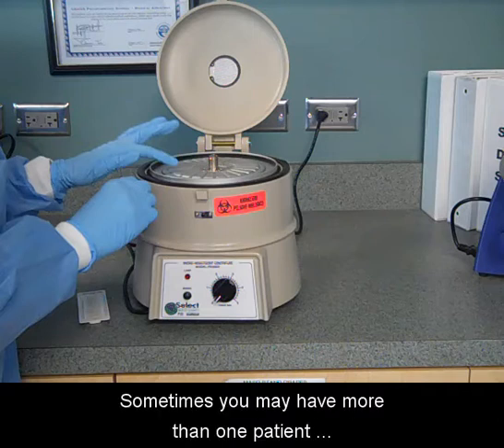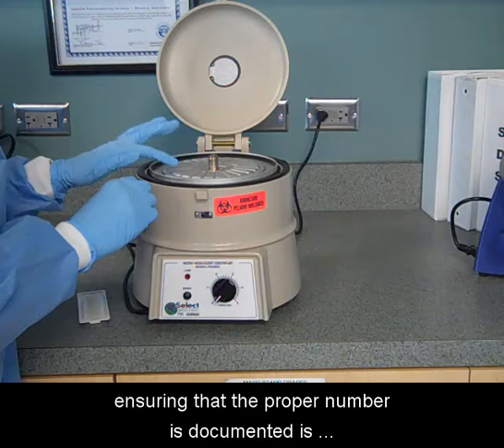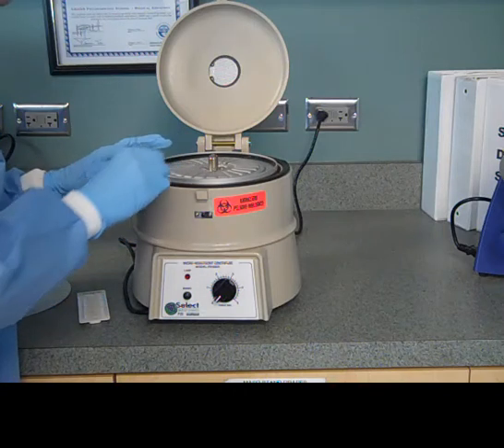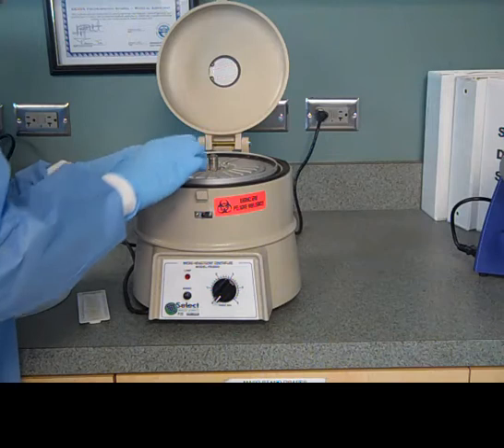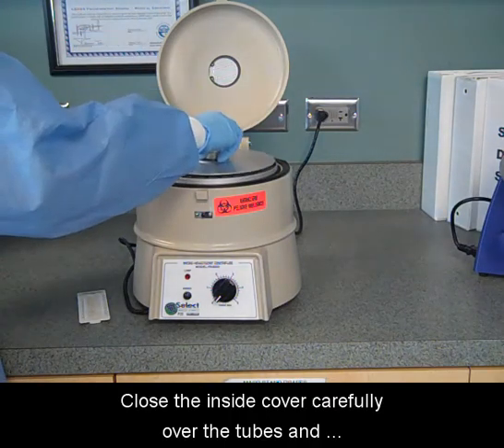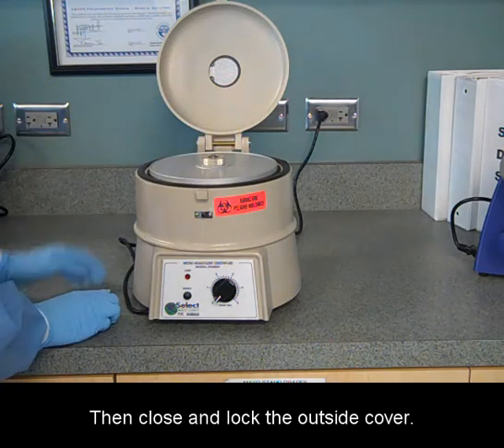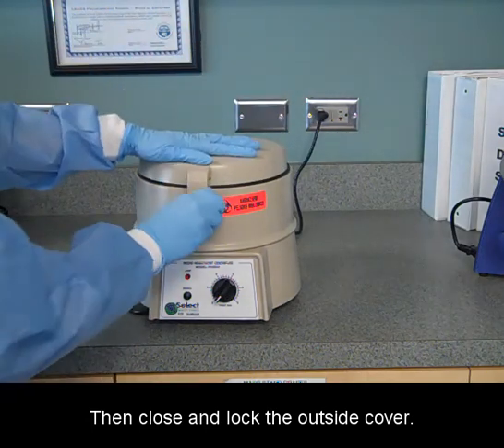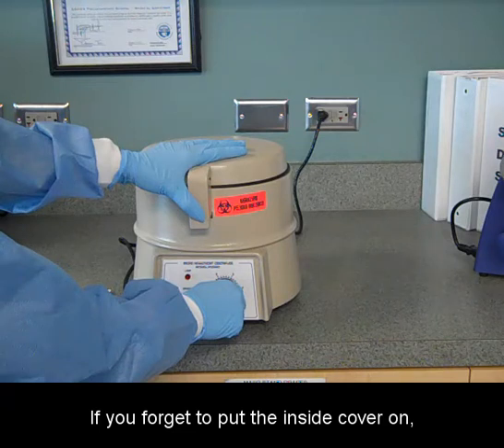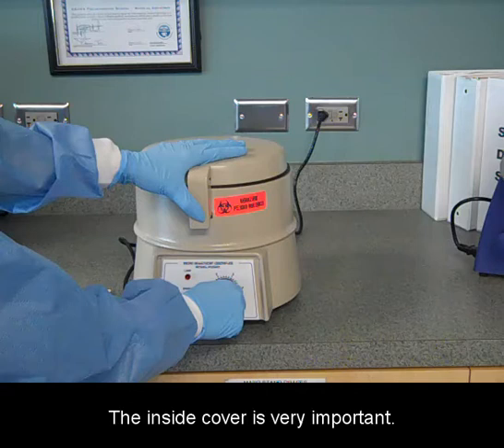Sometimes you may have more than one patient sample inside the machine, so ensuring that the proper number is documented is extremely important. Close the inside cover carefully over the tubes and lock it in place by turning the dial clockwise. Then close and lock the outside cover. Listen for it to click into place. If you forget to put the inside cover on, all of your samples will be ruined. The inside cover is very important.